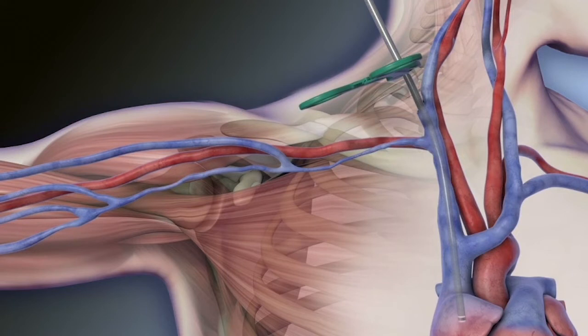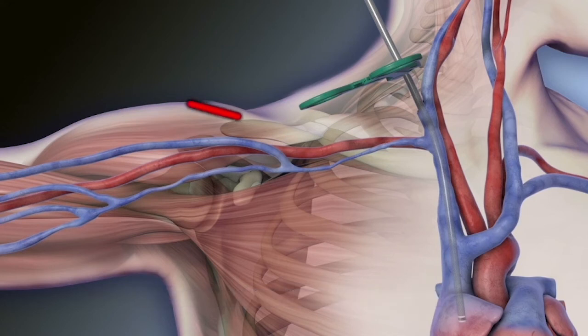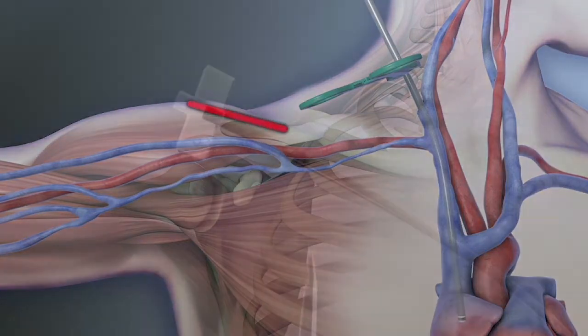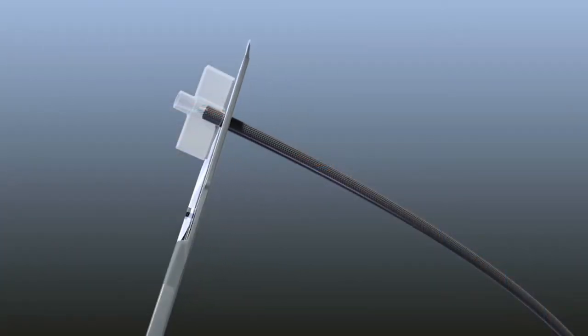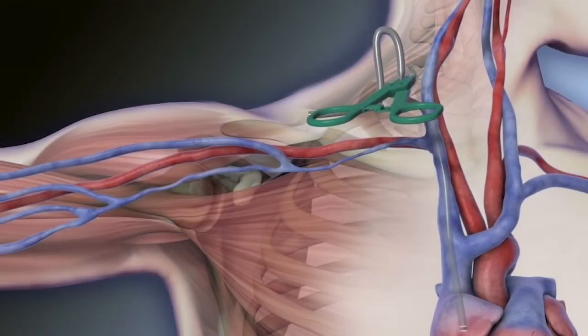Clamp the venous outflow component at the incision site. Create an incision at the deltopectoral groove. Cut the lower end off of the venous outflow component and tunnel from the neck incision to the DPG incision.